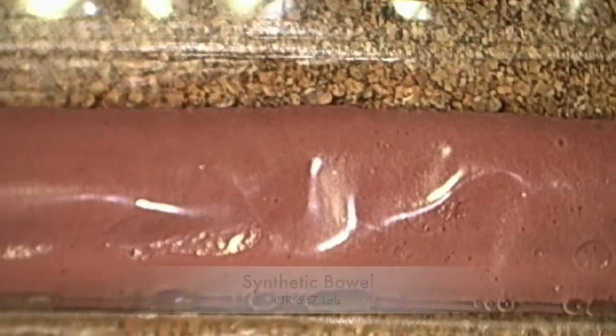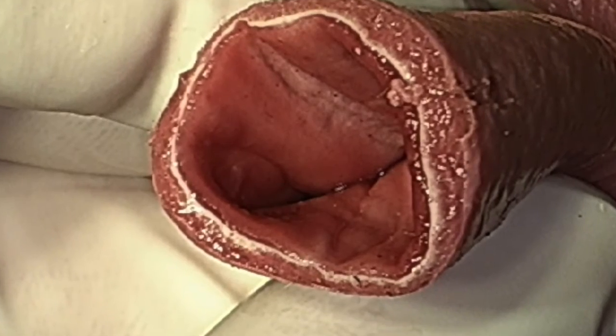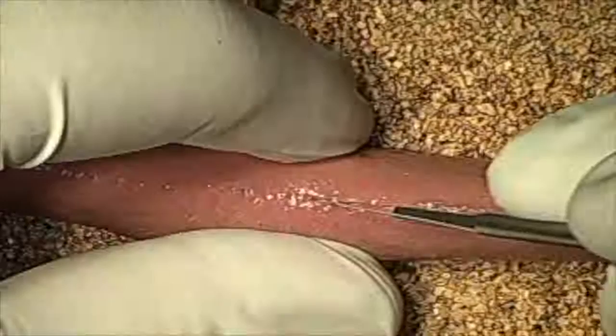We're going to start our synthetic bowel tutorial now. The white line is actually going to represent our submucosa in this exercise. We're going to pretend that there's a foreign body somewhere in the middle of the jejunum. And typically we cut over the aboral segment, so that usually is downstream.